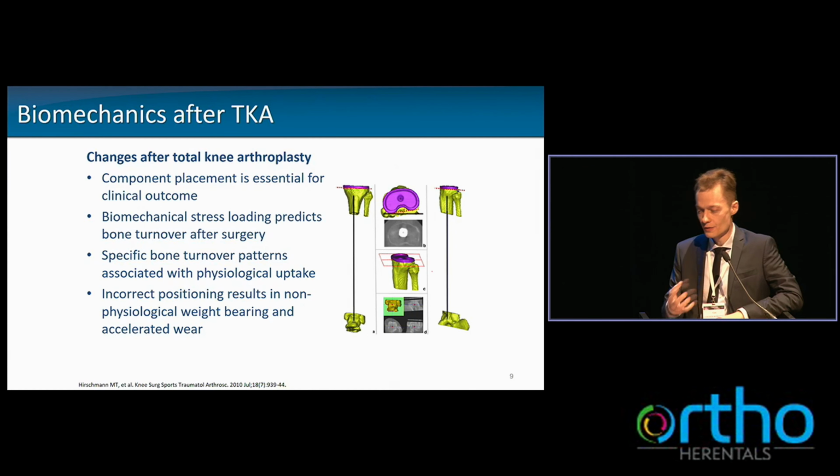So, as I told you, I do believe that in particular for assessment of painful total knee arthroplasty, bone SPECT-CT can be useful. And if you simply look at the reasons why revision surgery of these arthroplasties is performed, you see there's a multitude of causes that can be found, but interestingly they are spread right across the board, so you really have to take them all into account as a possible cause for the patient's problems.